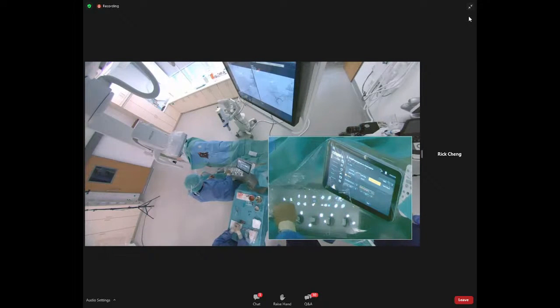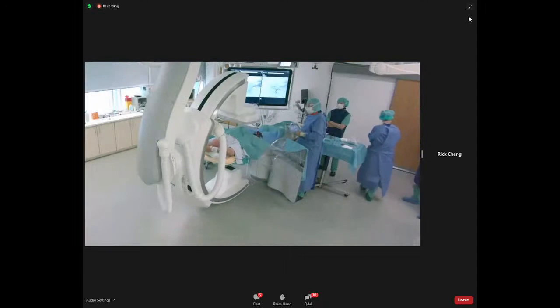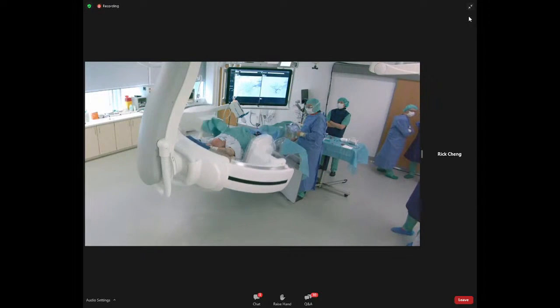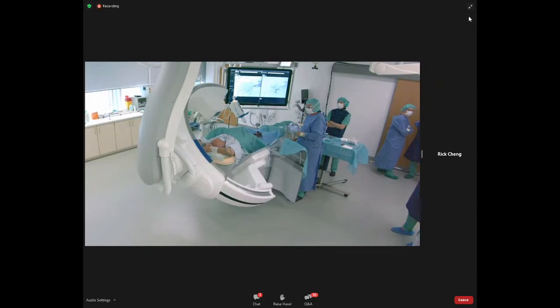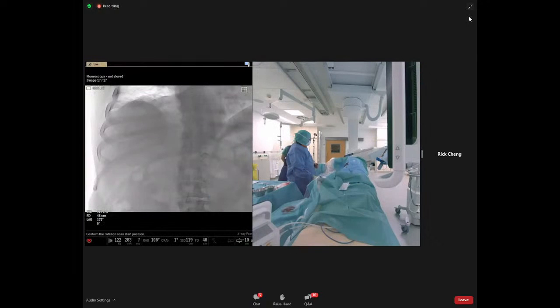Select the appropriate dual cone beam CT open trajectory protocol. Set the X-ray delay time and the interval time. Now press the Accept button and move the C-arm to the end position. You should be aware that during cone beam CT dual setup, the body guards are active. Press the Accept button again to move the C-arm to the start position.